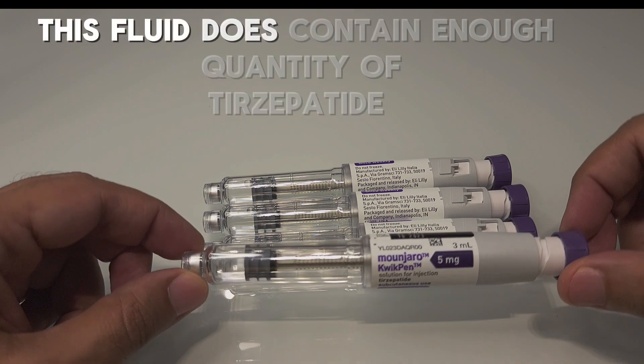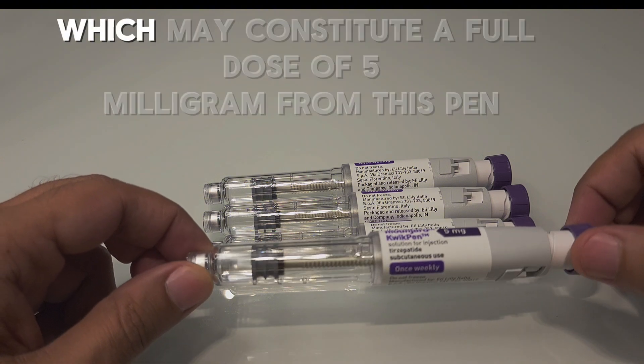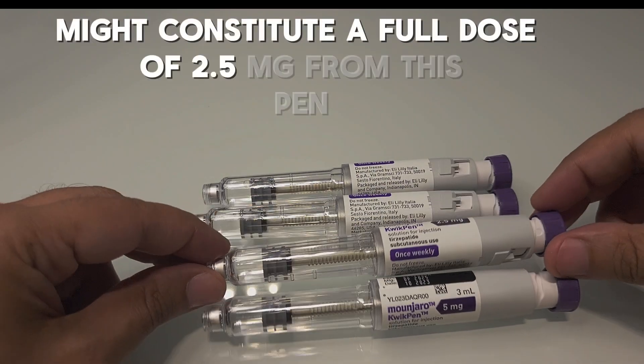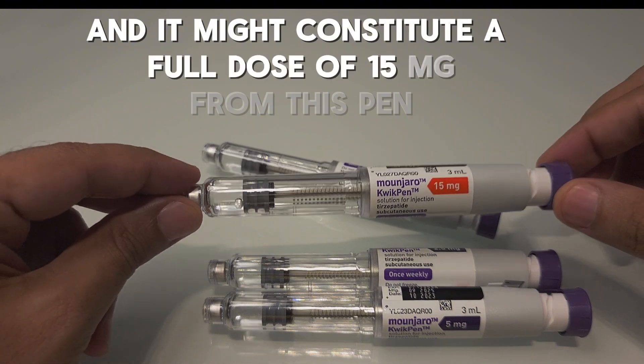This fluid does contain enough tirzepatide which may constitute a full dose of 5 milligram from this pen, it might constitute a full dose of 2.5 milligrams from this pen, and it might constitute a full dose of 15 milligrams from this pen.